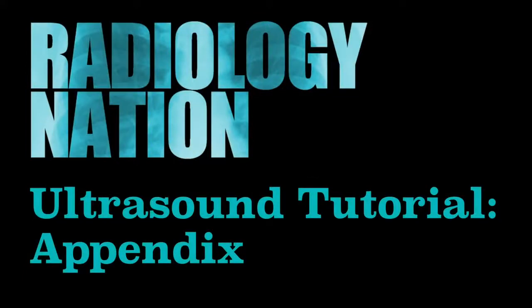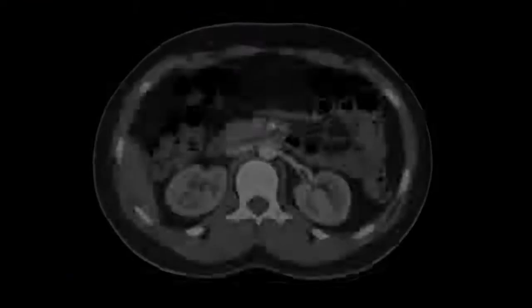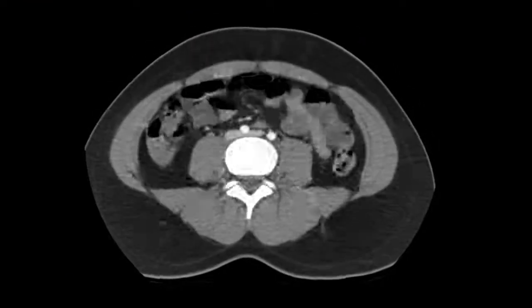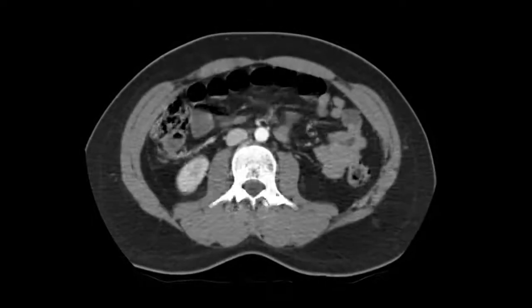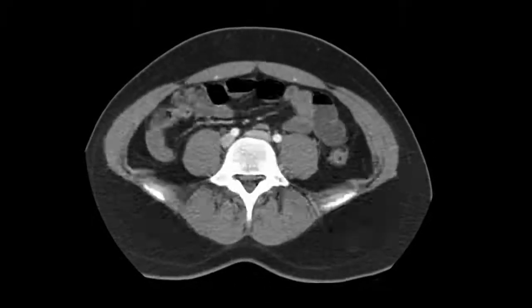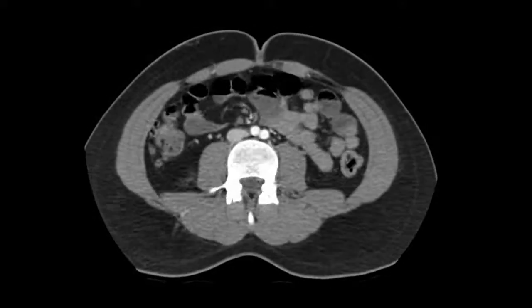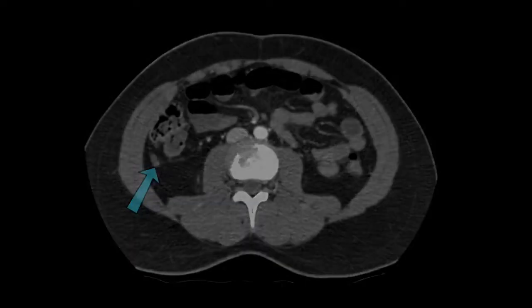Hello and welcome to this Radiology Nation ultrasound video tutorial on the appendix. Identifying the appendix on a CT scan can be a real difficulty. See if you can identify the appendix on this scan. You should be looking for a blind-ending tubular structure arising from the cecum. Now that we've seen what an appendix looks like on CT, let's have a look with ultrasound.